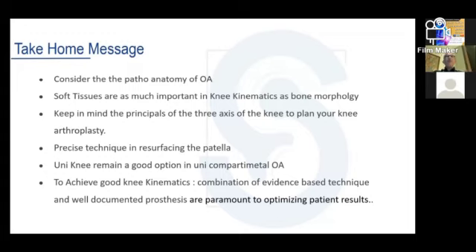Is it a soft tissue or a bone deformity? For soft tissue, we have to solve the soft tissue problem. For the deformity, we have to manage the deformity: either a pre-op osteotomy to bring the knee back to a normal situation and then put a total prosthesis, or, if you have a recurvatum from bone deformity, it can be corrected by a new positioning of the prosthesis in a way that you will not have any recurvatum post-op, so you modify the position of the distal component of the femur. Right, we are not discussing such situations like we discussed in the talk.